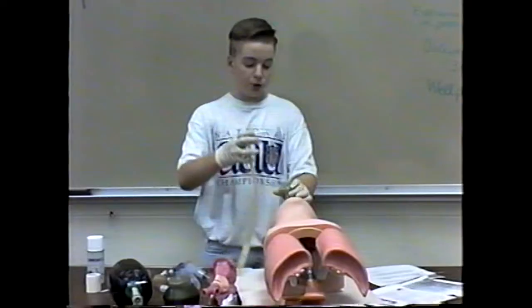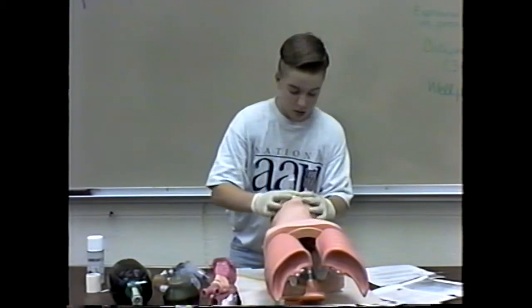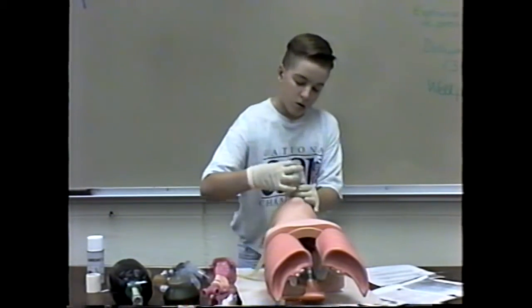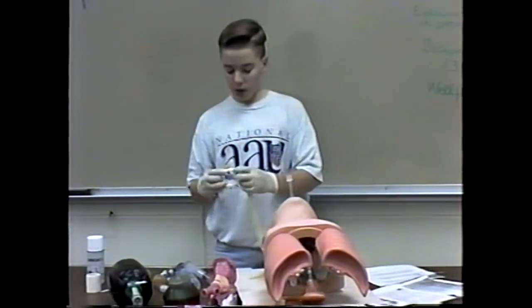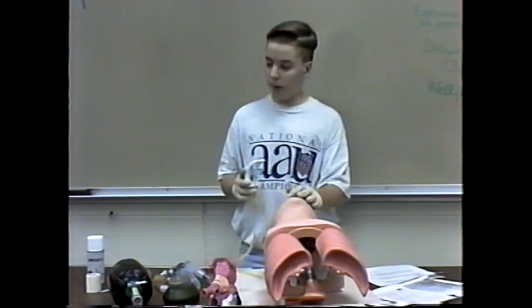This is used just to hold the tube in place. It also has two things going down there to hold the tube in place, and it's also a bite guard, so the person can't bite the tube.